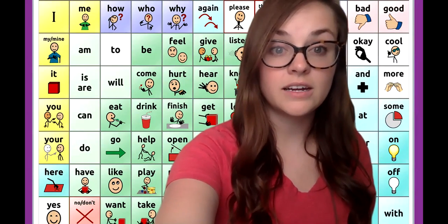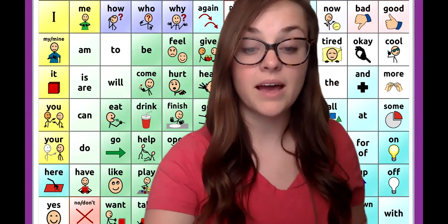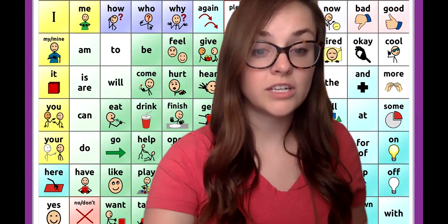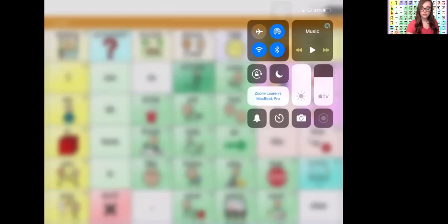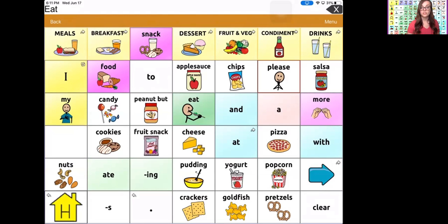A shortcut for sharing via AirPlay is Command-Shift-S on a Mac, and it would be Alt-Shift-S as in share for Windows. Make sure that you share your computer sound and optimize your screen for a video clip, and then all you have to do is mirror to your computer. At that time, anything you press, like "eat," will show up on your screen.